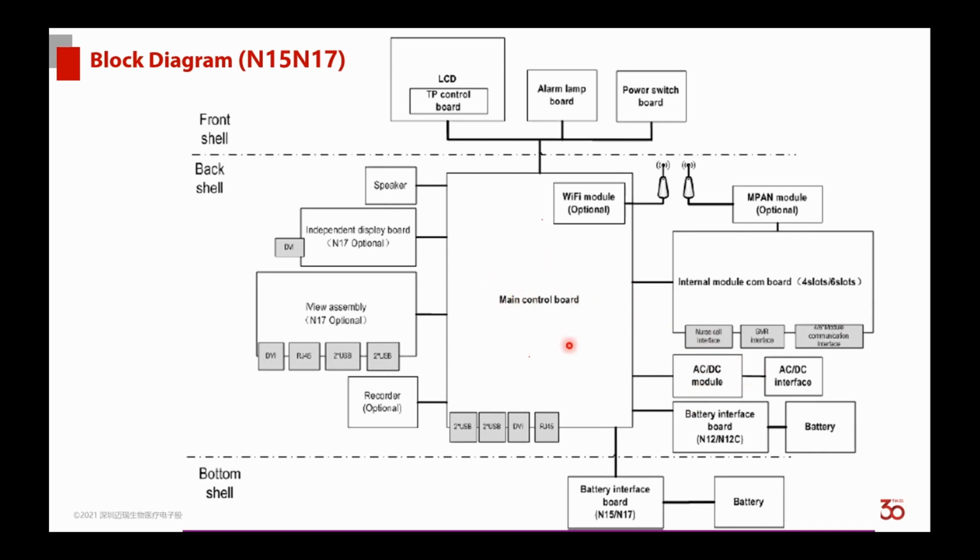So when you meet some kind of voltage problem, for example, when you switch on the LCD screen, you can hear the NIBP pump make a small noise, which means that the monitor is normally turned on, but there's no display on the LCD screen. Maybe the problem is the different voltage delivered to the LCD screen, so you can check it in the main board.